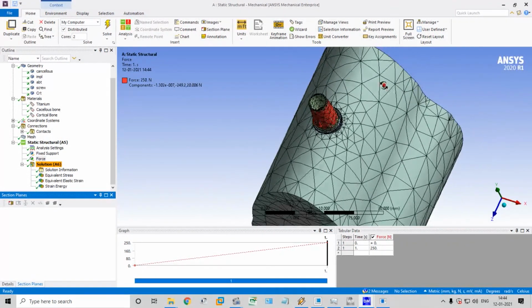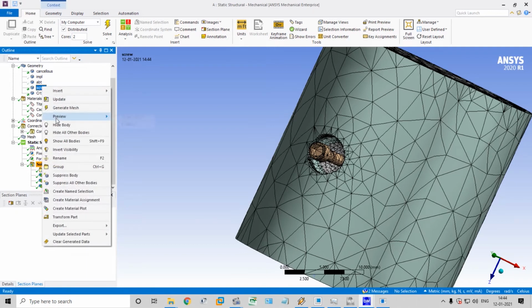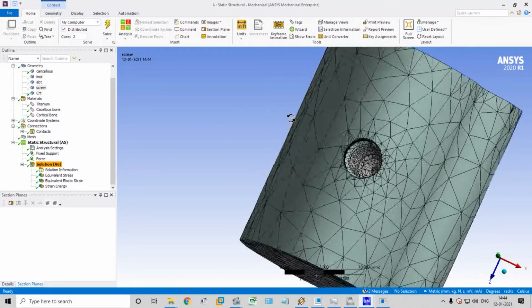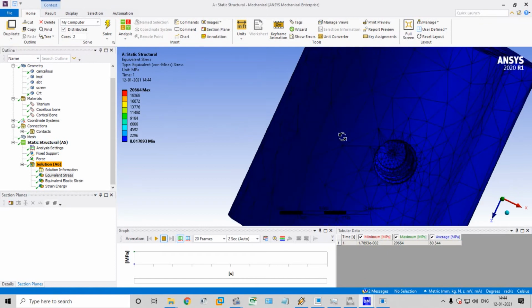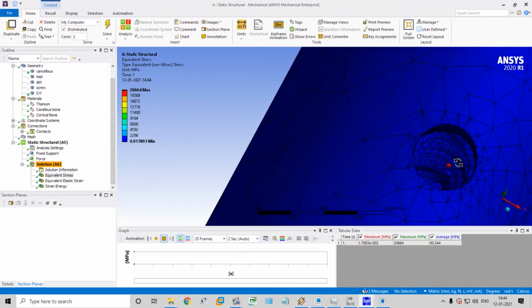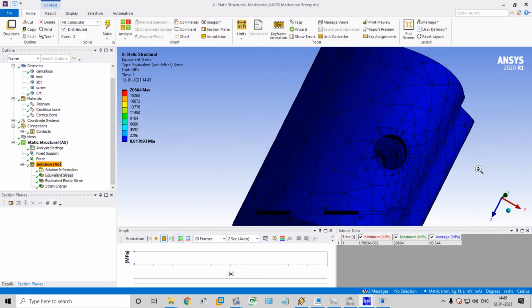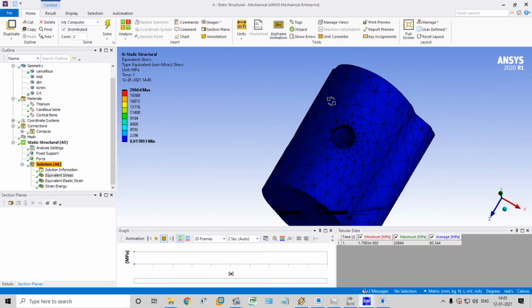Okay, we can see part by part also. We can hide the body as noted before. Screw hide, right. You can play the animation here. We can notice the differential changes while loading. Okay, next is the sectioning of the model.